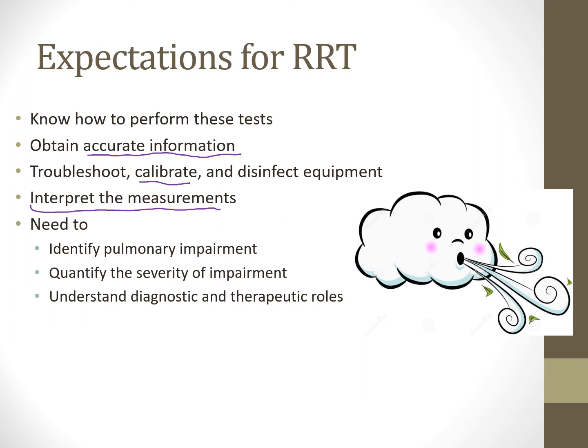I want you to understand what a combined restrictive and obstructive pulmonary function test looks like, and we will practice those in part 2. I want to make sure that you are able to interpret those so that you understand the data as well. I want you to see what it means if a DLCO is low or if a DLCO is high.